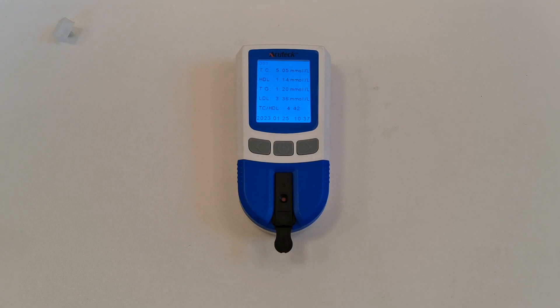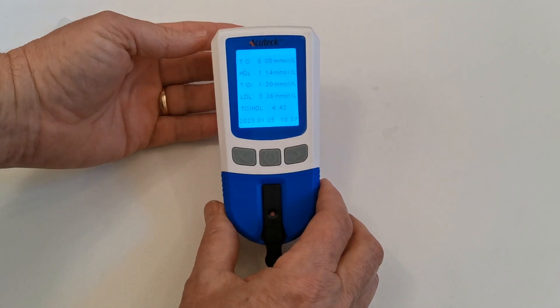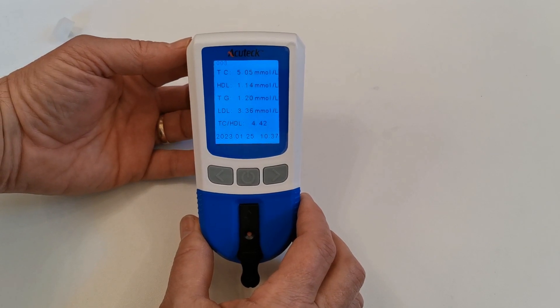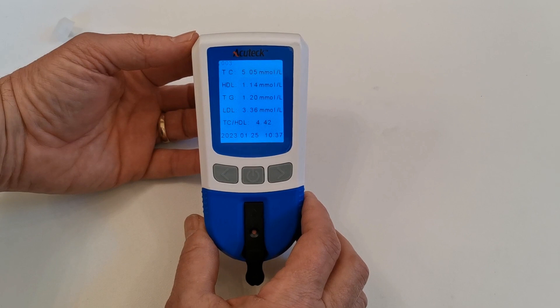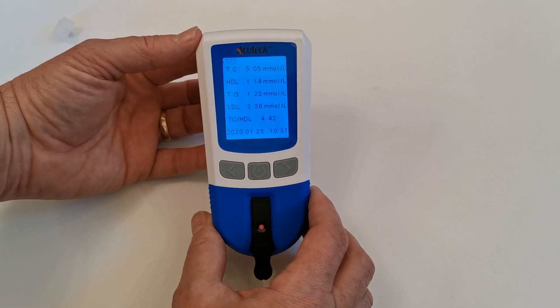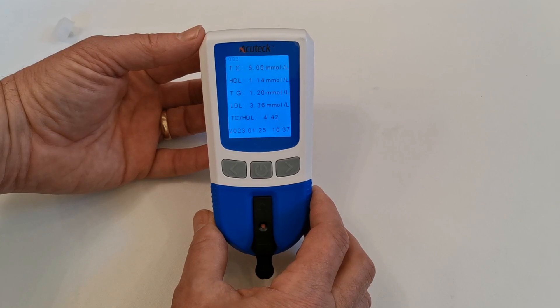A good lance technique is absolutely critical to getting hospital grade results from your cholesterol meter. When the meter has analysed the sample, it will display your five result readings on the LCD screen with the time and date of the test. My total cholesterol on this sample is 5.05 millimoles per litre, which I'm quite happy with. The HDL is 1.14, which could be a little better. My triglycerides are 1.2, which is very good.